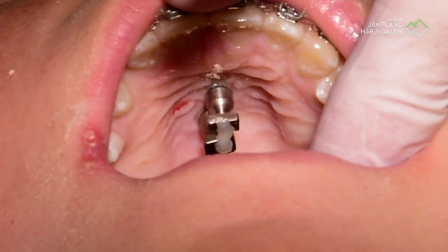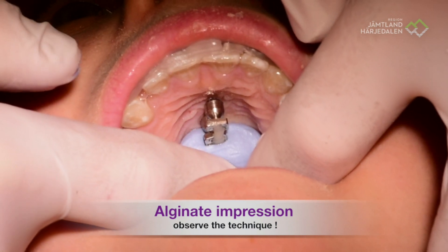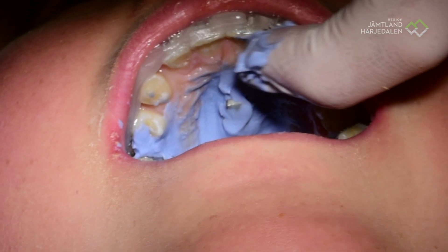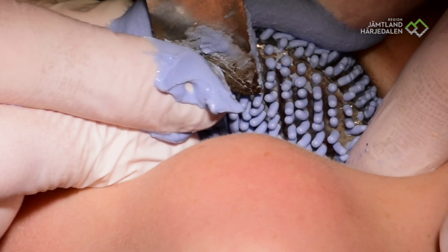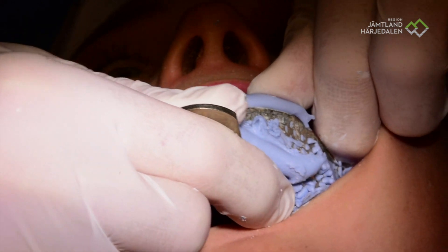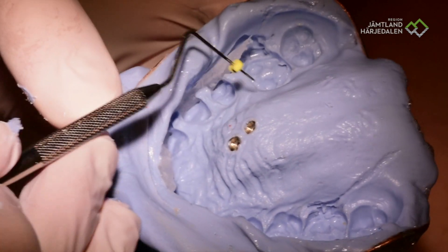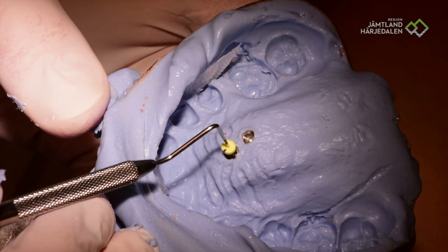Filling in between from the back of the impression caps, pushing forward — filling in between but not above. Breathing — that is the most important thing. If it is sitting very well, sometimes it is very difficult to remove because of the appliance. Get it out. The impression has to be perfect — you have to see that the impression material is completely around with no air bubbles whatsoever. The mucosa is perfect, the teeth are perfect, everything is very clear in the palate. The impression caps are coming out very beautifully.